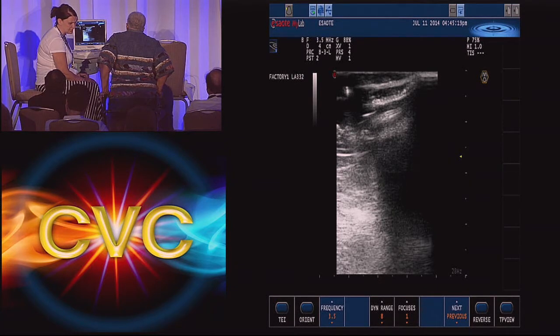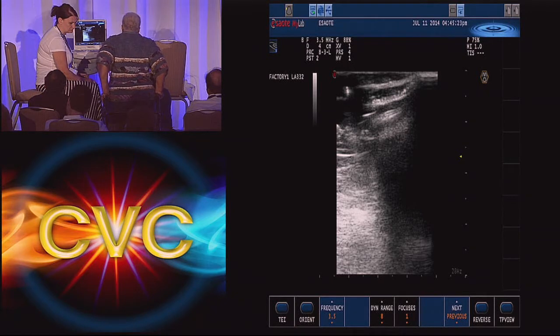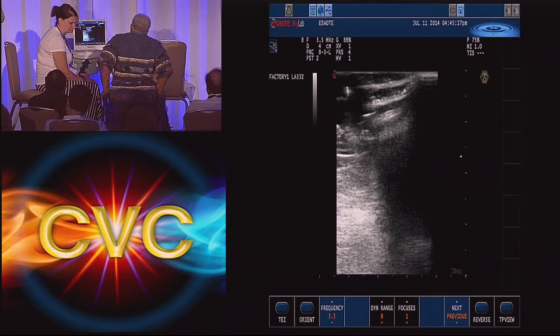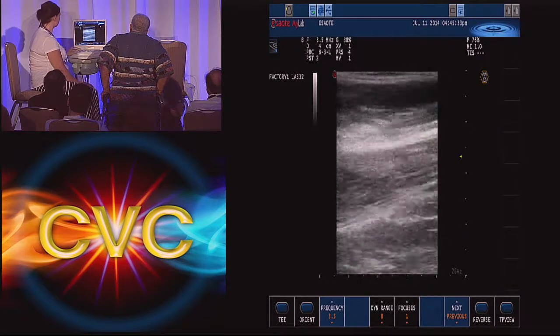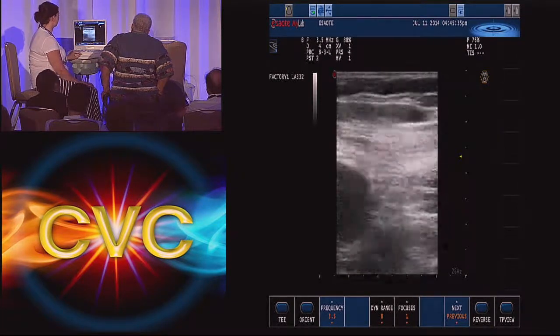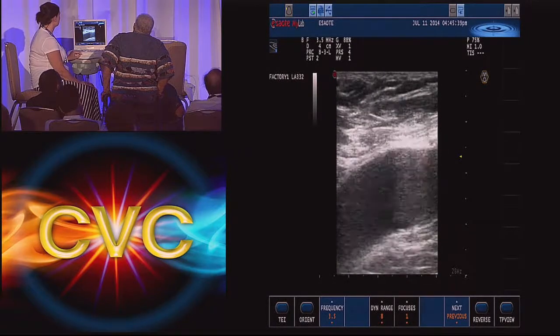Never assume, because sometimes, if your catheter is up in, let's say, the iliac, but your ultrasound, the way you do it, looks like the tip is right in your saphenous. You gotta triple confirm that you're not in the common femoral, especially when you're doing an ablation. Look at that junction, there we go.